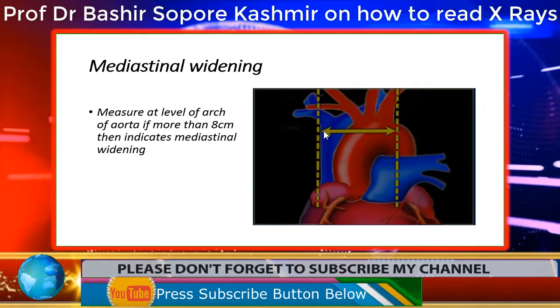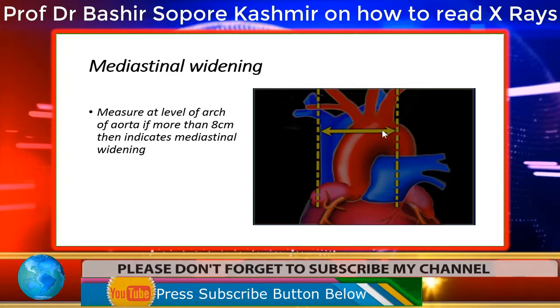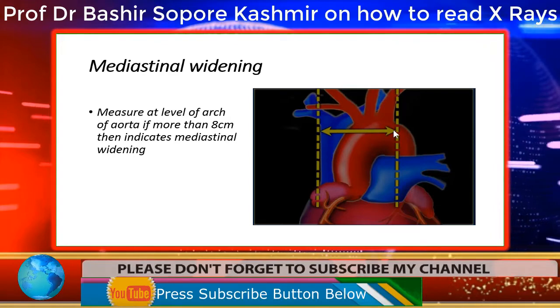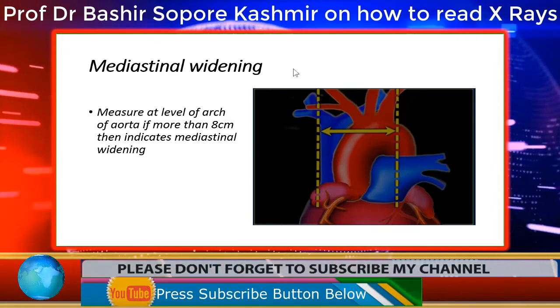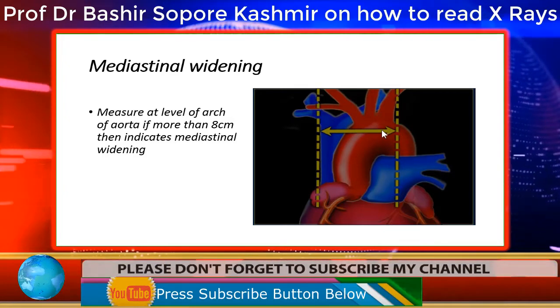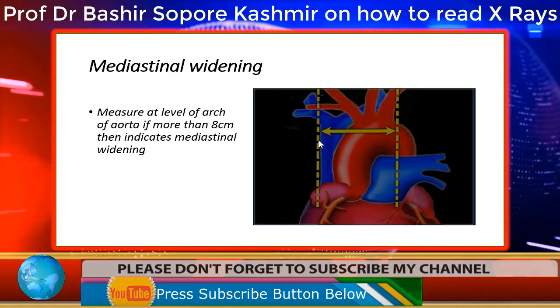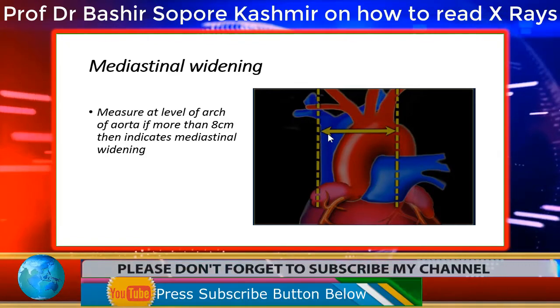So you measure across the arch of the aorta, right? This is the point where you have to measure the mediastinum, and if it is more than 8 centimeters, then we call it mediastinal enlargement or mediastinal widening.